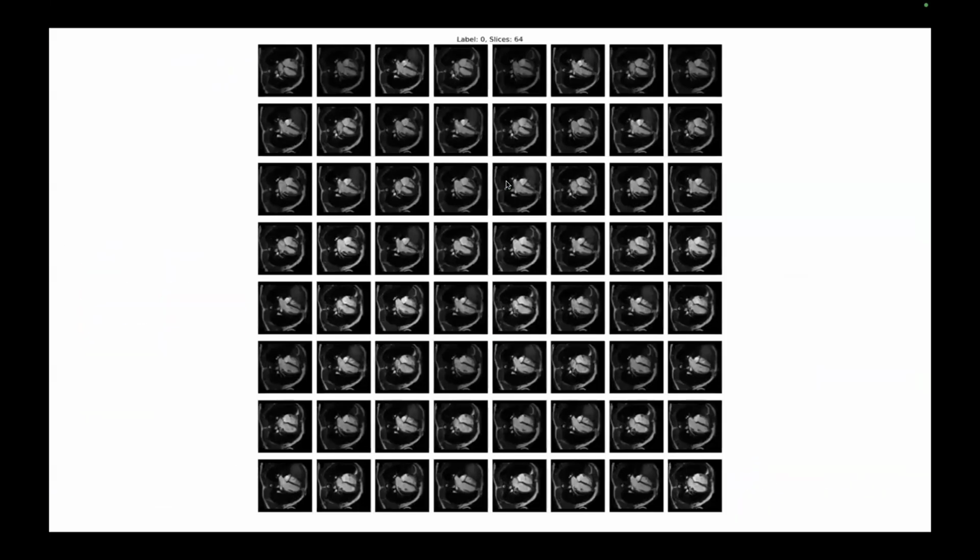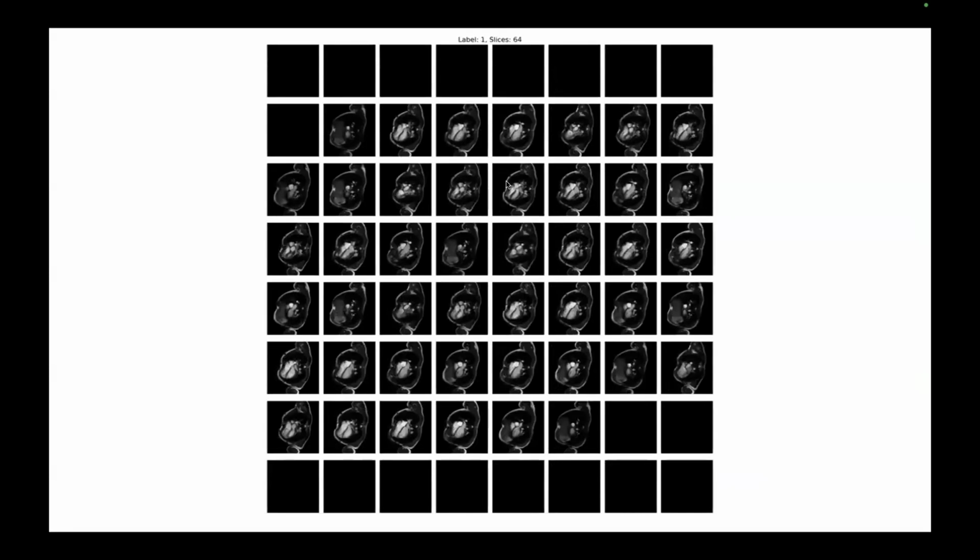Yeah, I start to see what's happening. They're completely rotated by 180 degrees between patients for some reason, which I don't know how or why. Even the DICOMs don't have that information, and I don't understand why that is the case. They should be from the viewpoint of a person viewing it, like a radiologist's point of view, and should all be aligned the same way, but they're not, which makes it very difficult for ease of use of the data.